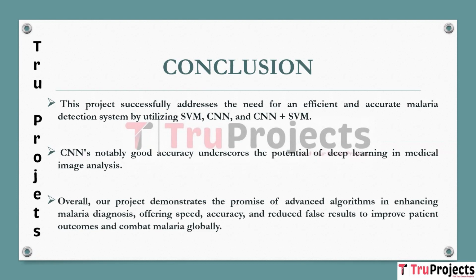Overall, the project has demonstrated the feasibility of using advanced algorithms for image processing and machine learning to enhance malaria diagnosis. The combination of speed, accuracy and reduced instances of false results holds great promise for improving patient outcomes and contributing to the global fight against malaria.